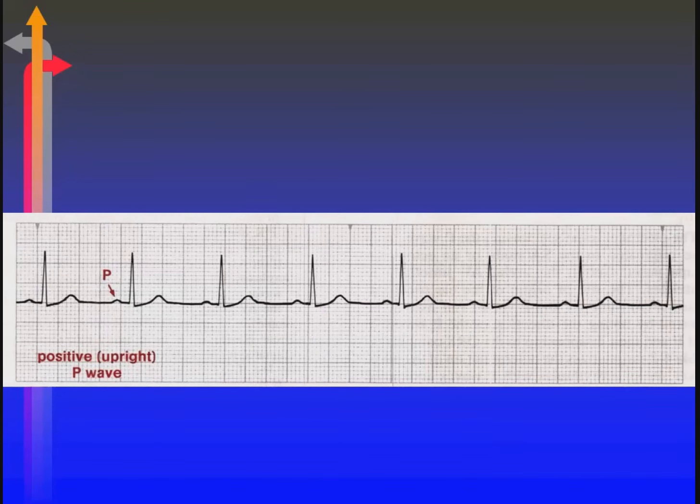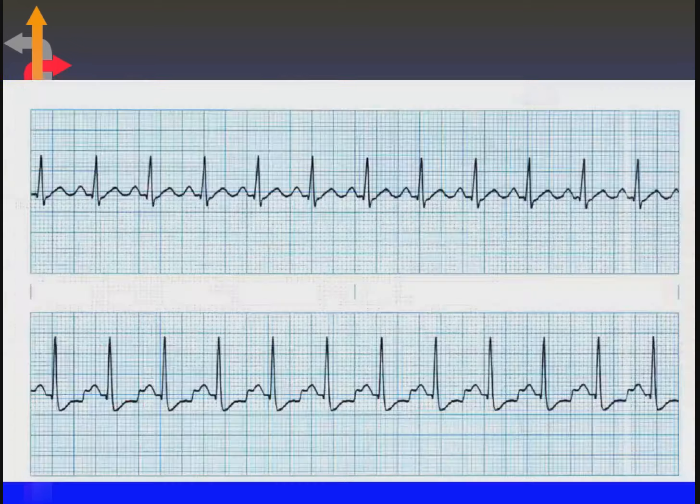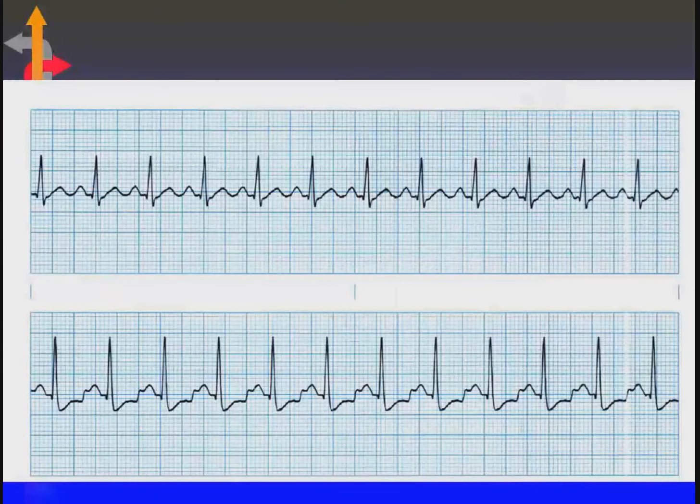Again, a 6-second strip. 1, 2, 3, 4, 5, 6, 7, almost 8. So high 70s. And again, you can do the other mechanisms in the same exact fashion. Cool? So I would feel comfortable giving you a tracing and asking what's the rate. And there are some more examples to practice with.